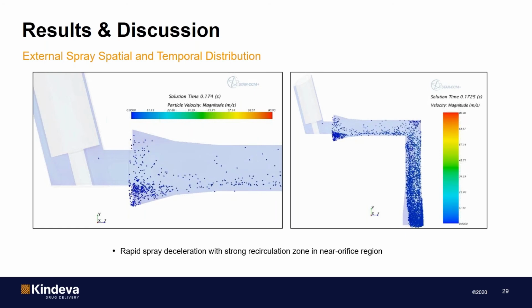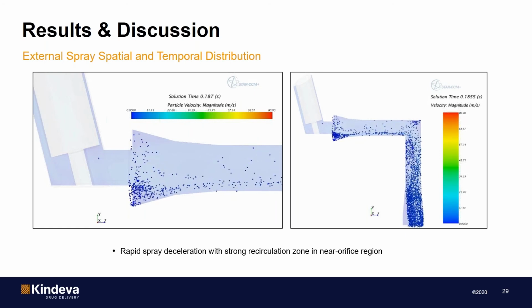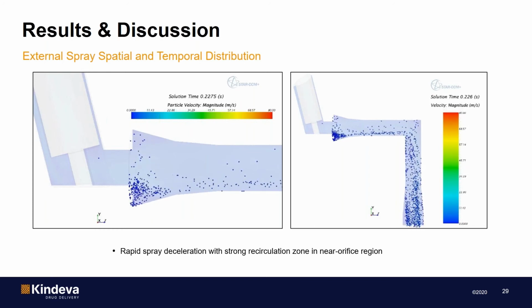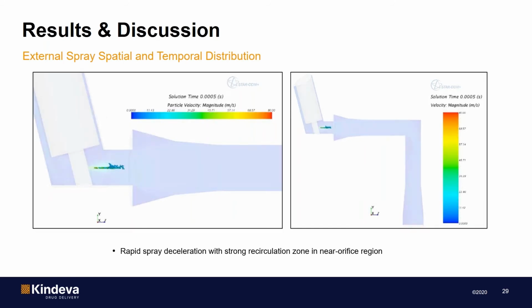And towards the end of the actuation, you can see that the spray basically exits the outlet region of the induction port at a very, very low velocity, probably below 1 meter per second. So the key thing here is that we observe a very strong recirculation zone very close to the spray source, and also a rapid deceleration rate of the spray.